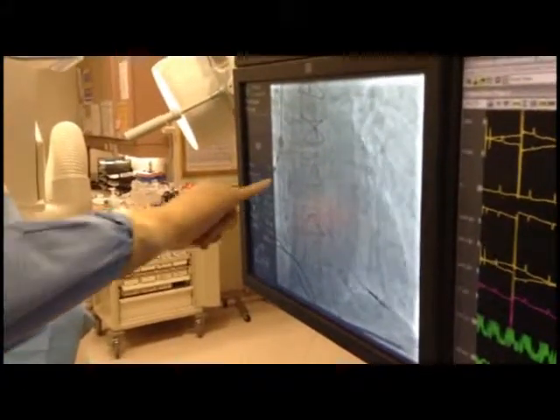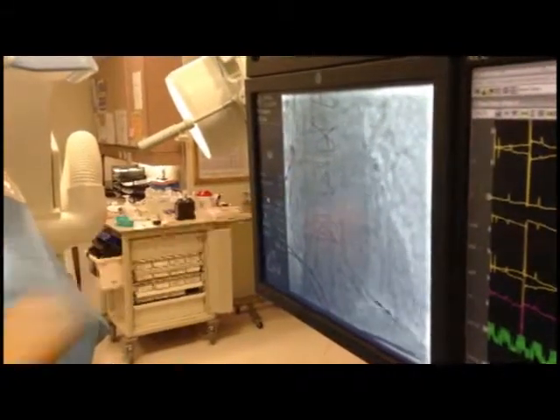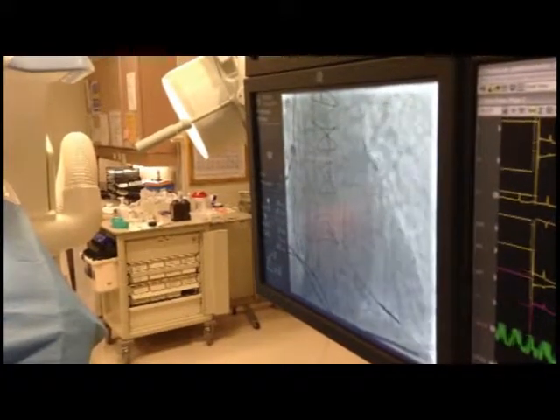And there you see the screw being deployed out of that lead, gripping into the underlying muscle.